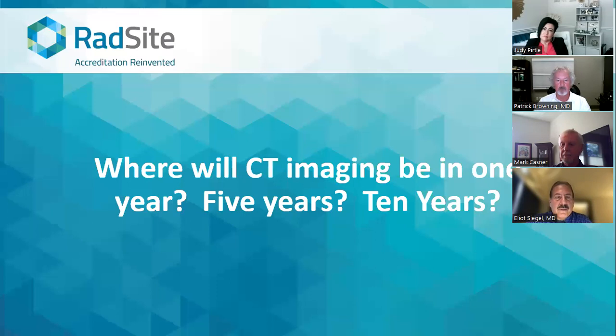Yeah, so I agree with Judy and Patrick on a number of points. I think we're going to increasingly make the transition where the baseline CT scanner is going to be multi-slice and multispectral, as we go to 5 to 10 years. Patrick's making a really important point that, already even this year, we're seeing more and more remote CT applications, and we're figuring out to what extent one tech can operate multiple systems. How does that stay within the requirements of state laws regarding who can operate the CT scanner? I think the same way we're seeing automation in our shopping malls and restaurants and other places, we're going to be seeing it in CT also.